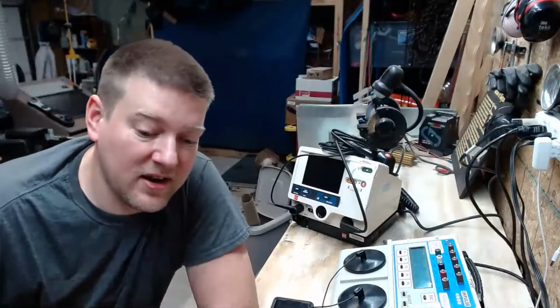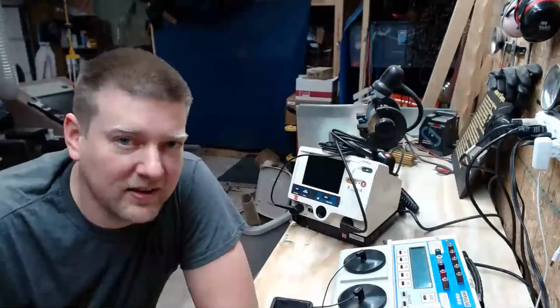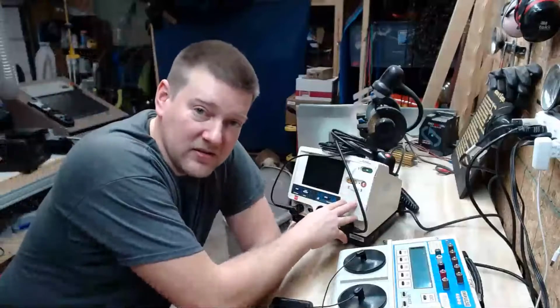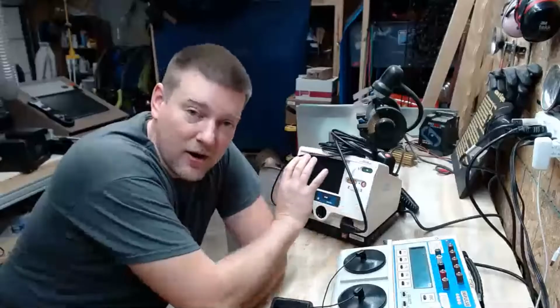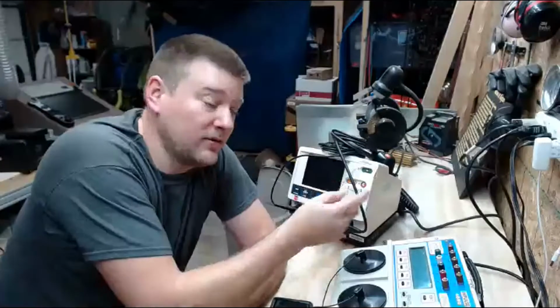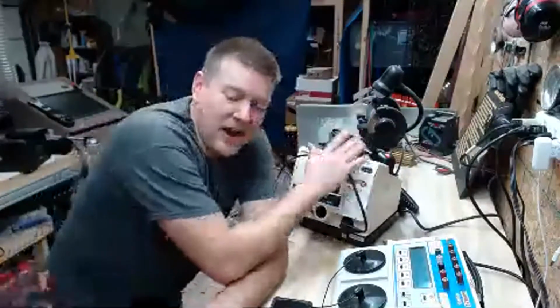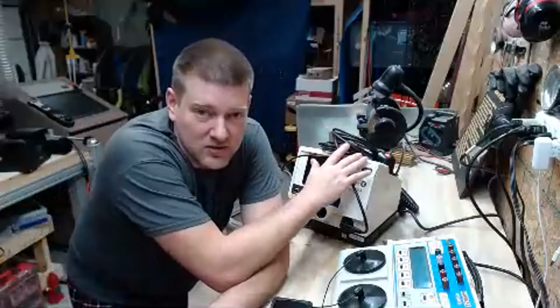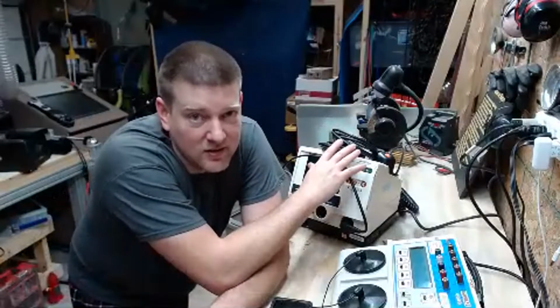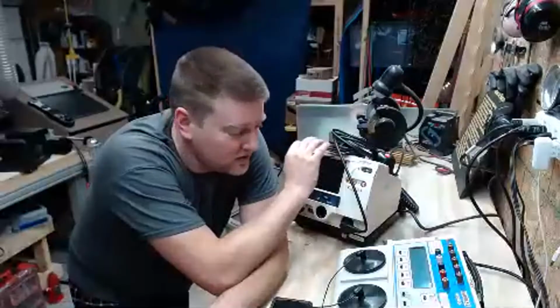This guy here is going to get isolated because it shut down like that. I'm going to see if I can duplicate that tomorrow, which means I'm also going to put it in pace mode. I'm going to do some pacing, and then shut the power off and get it to go back into normal defib mode and see if it can do it. Because if it shuts itself off like that again, that's a problem. And if you guys ever have a situation where you don't trust the device, especially one of these, ship it back to the manufacturer, guys. Ship it back. Do not even think twice about it. If your hospital says they don't want to pay for it, say, who cares?